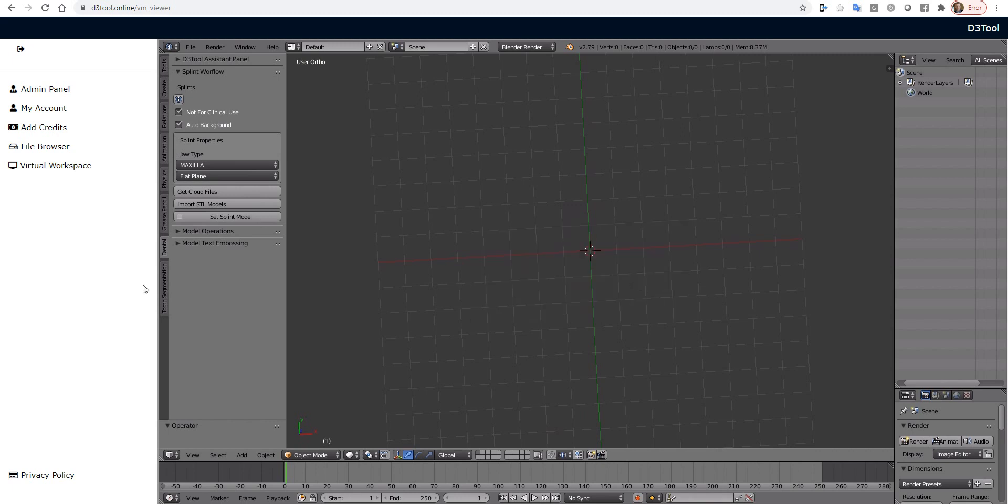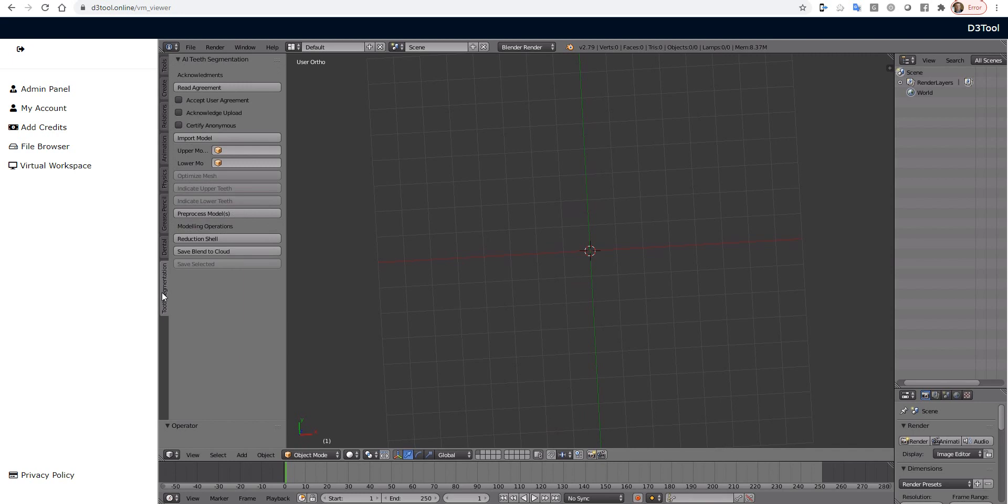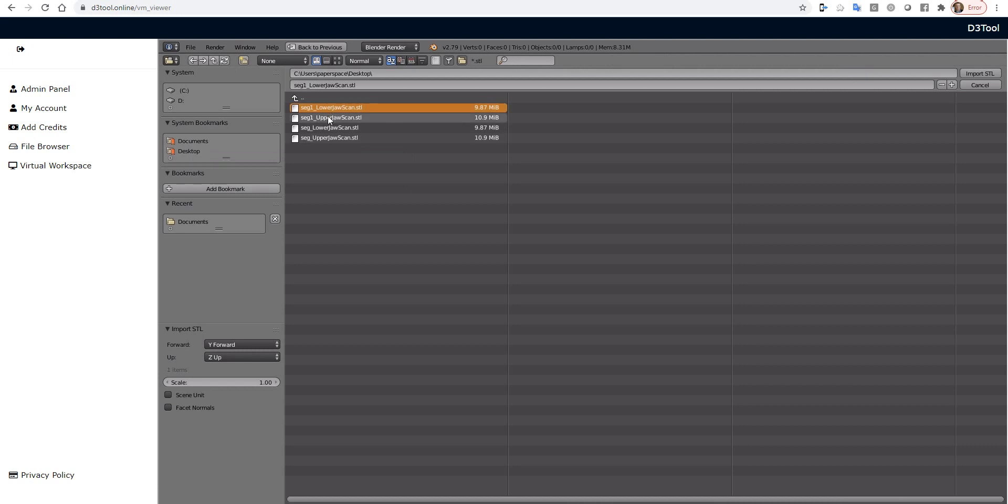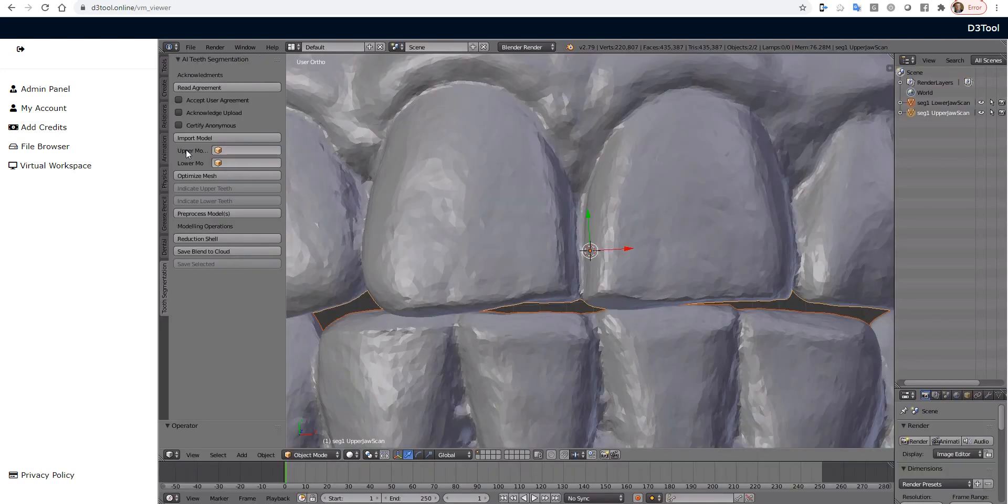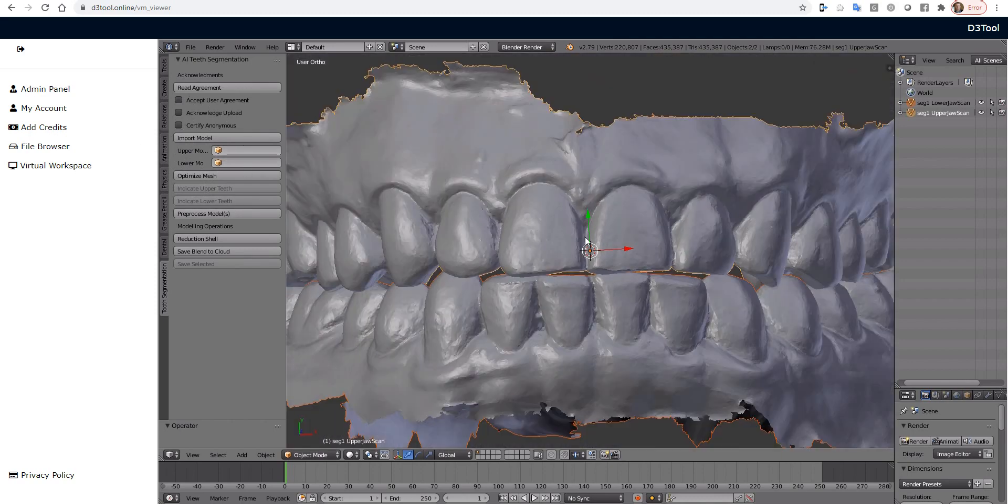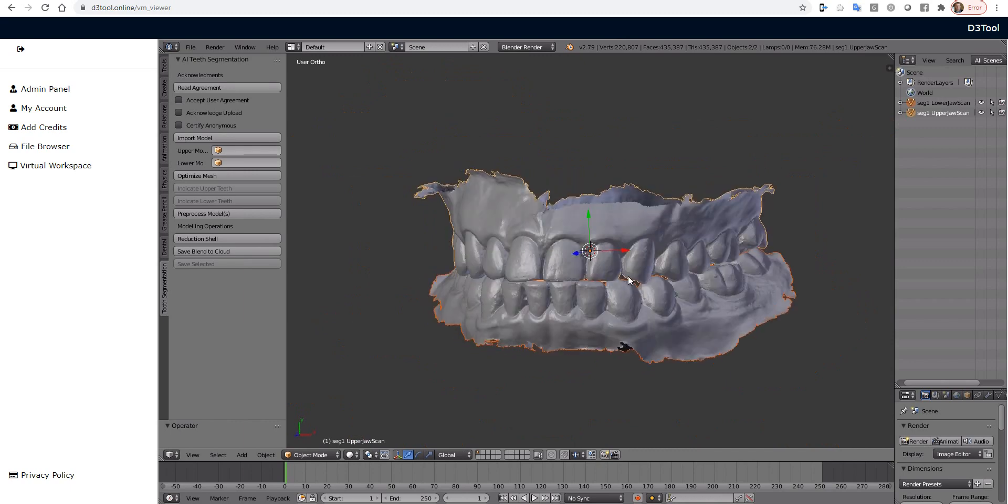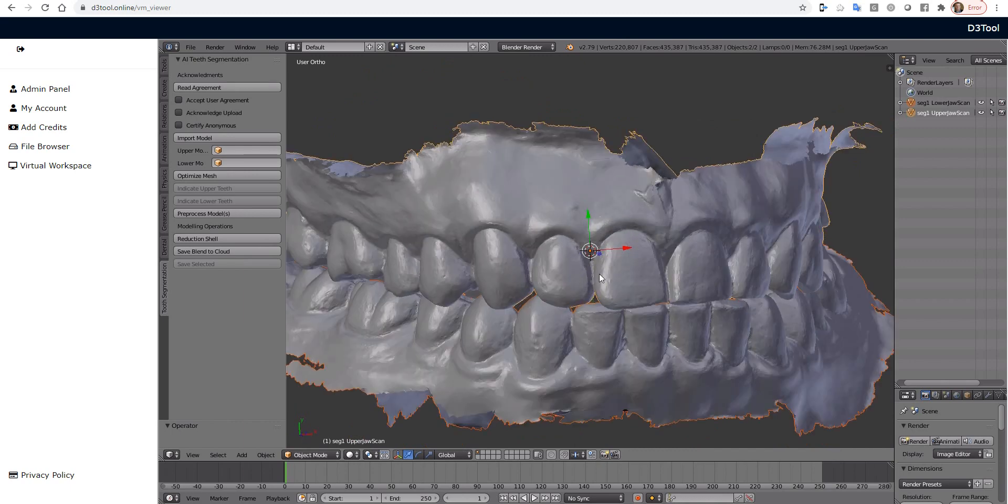All right, now I'm going to switch over to the Tooth Segmentation tab and press Import Model. So these are the ones I just uploaded. So left-click, shift, left-click. Now we're going to import those into our 3D space. And this is in the Desktop folder. So anything you drag and drop just goes to the Desktop of your virtual workspace.